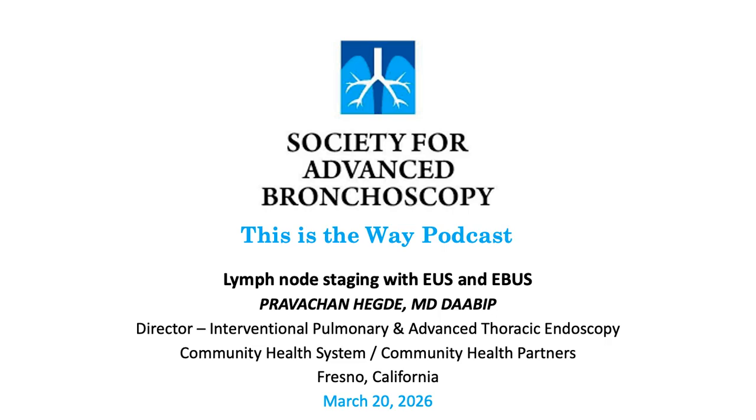Usually after about 25 to 50 cases, people get more familiar. And in the GI literature, they say after about 140 cases, you become very proficient in it. But obviously, like with any procedure, there's a learning curve. And to me, the learning curve was similar to learning EBUS.